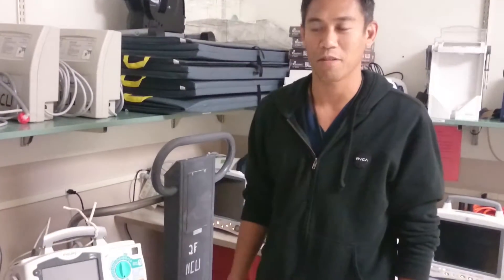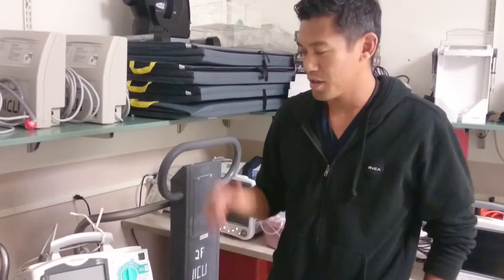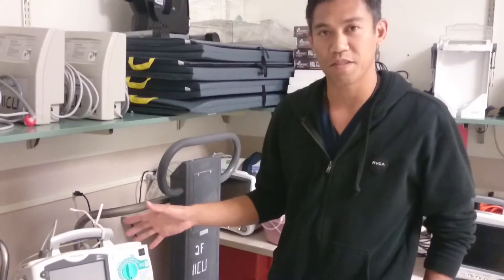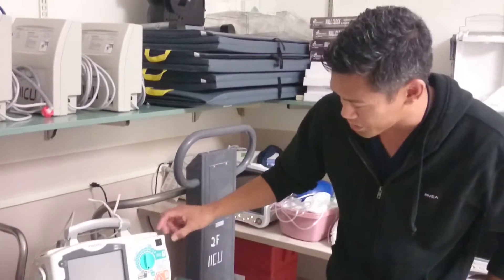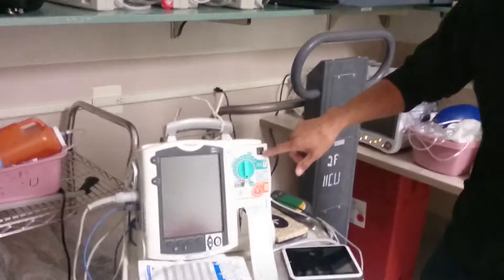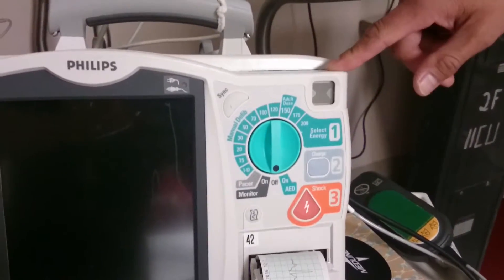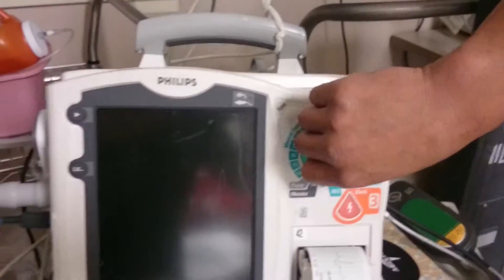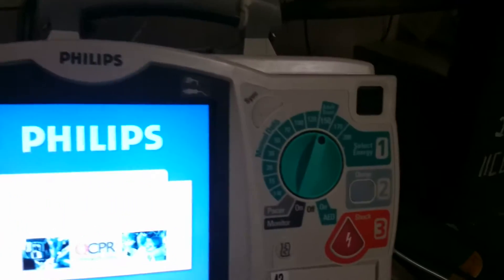We're going to go over how to defibrillate a patient using the Phillips defibrillator. Given that you've done all of your checks and made sure that the right upper corner has the hourglass flashing — meaning it's functional — you should be able to turn the defibrillator dial up to 150.